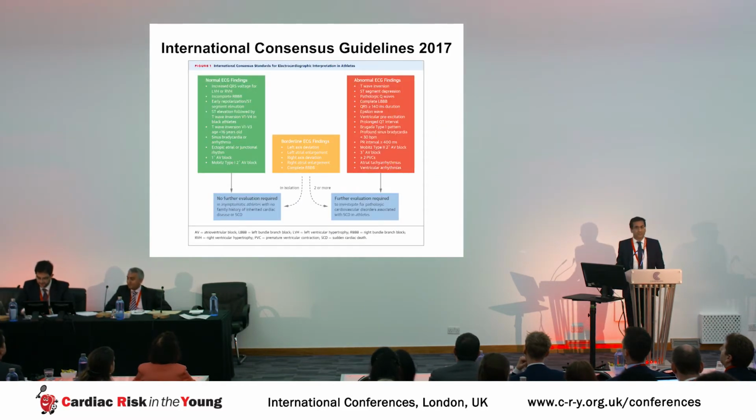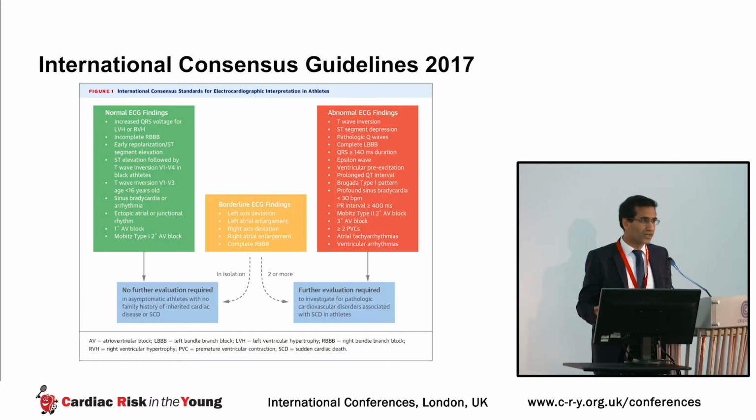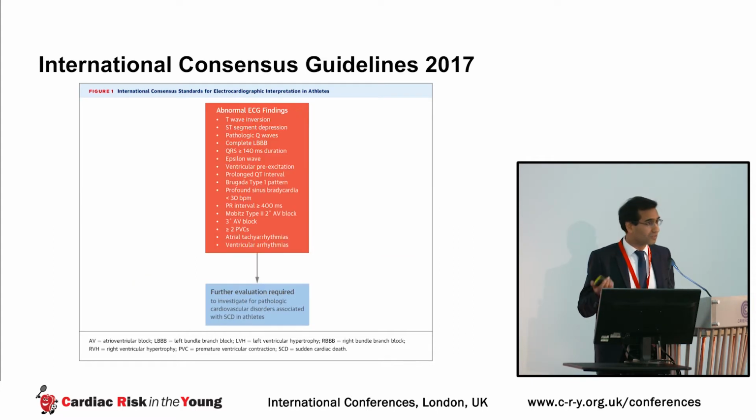And finally, in 2017, we received some truly evidence-based guidelines on the interpretation of an athlete's ECG. And it's from these guidelines that I'm going to take you through some of the abnormal ECG findings, specifically those that should raise awareness of a cardiomyopathy.